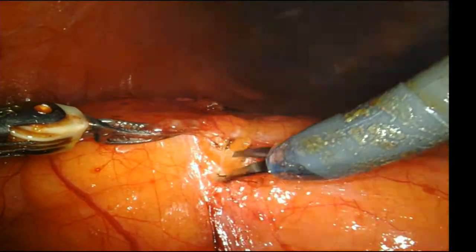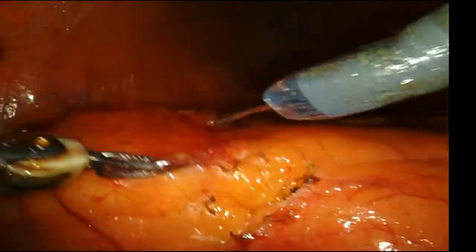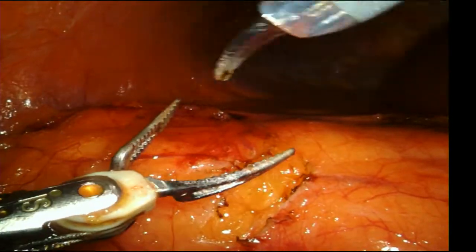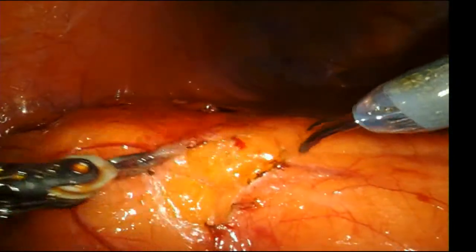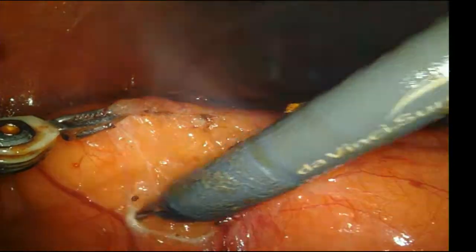Ideally, when we're doing the resection, we wanna have the tumor staring us end on. So if a tumor's sticking out this way, I don't want to cut it out this way. I want to turn it so that the tumor's sticking at me and then I can cut under it. So that's what we're going to try to achieve here by rotating the kidney a little bit.